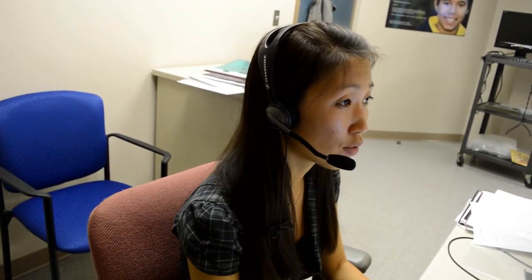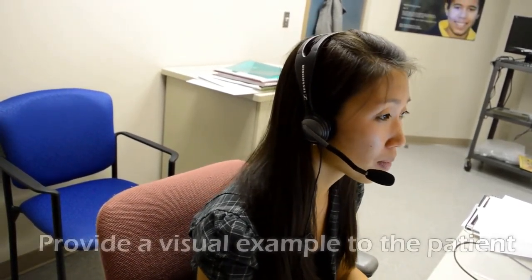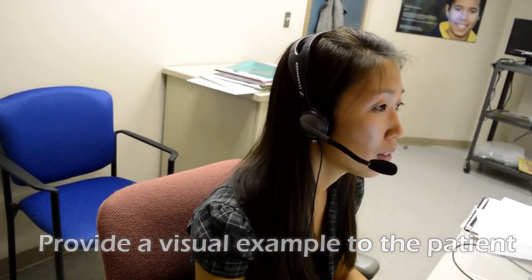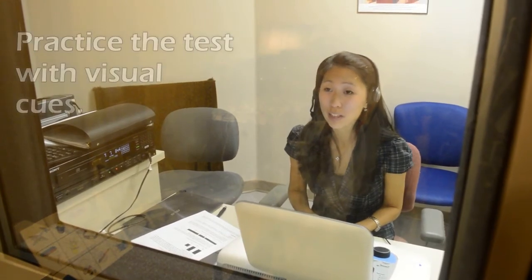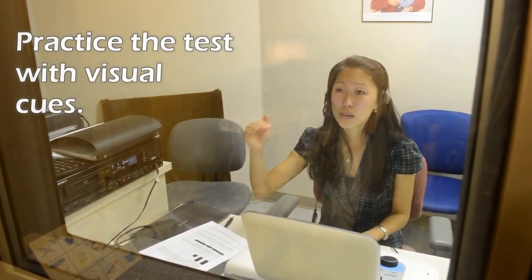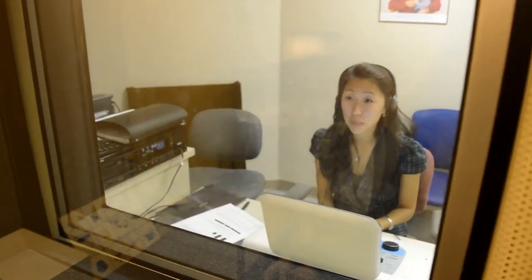Instruct the patient: You'll be hearing three successive tones. Each tone will either be high-pitched or low-pitched. For example, low, high, low. Now it's your turn — guess what you think these three tones are. Patient hears tones and responds: High, high, low. Clinician: Great job. Now let's try it once more. Patient responds: Low, high, low.